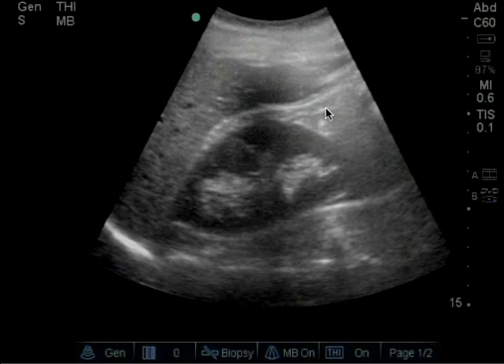This is similar to what you would see in the pericardial fat pad. This is not free fluid. There have been cases where this has been called free fluid, resulting in a false positive.